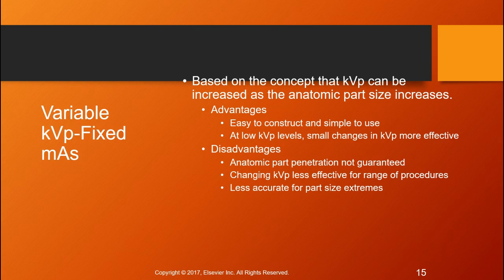Now with the variable kVp, they're saying the advantages are it's easy to construct and simple to use. Yes, you just look at the chart, you see what size body part you've measured your patient to be, and you use that technique, okay?